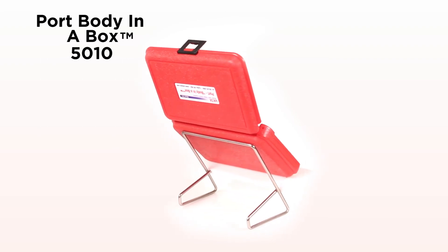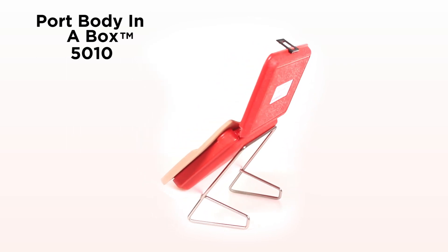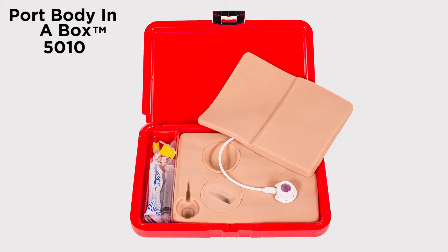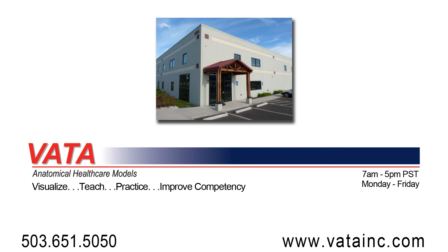This is a great cost-effective model for hands-on practice to build confidence and experience in the practice of palpating and access of ports that can be easily transferred to direct patient care. Port Body in a Box Model 5010 is available in lightly pigmented and darkly pigmented colors.